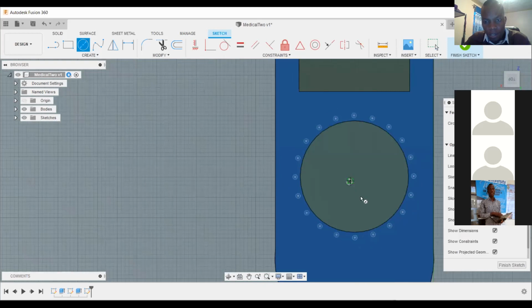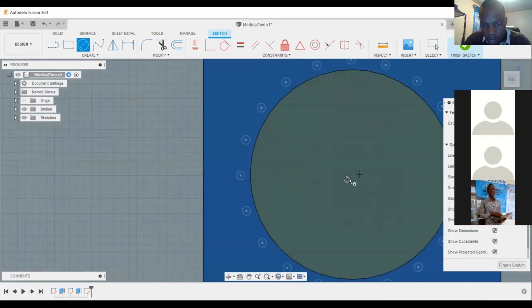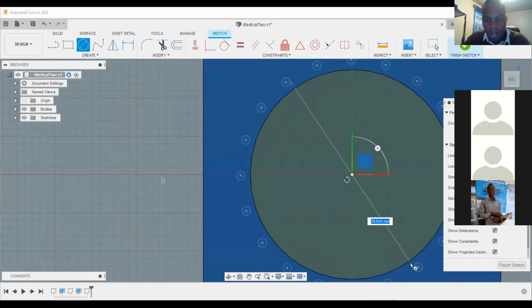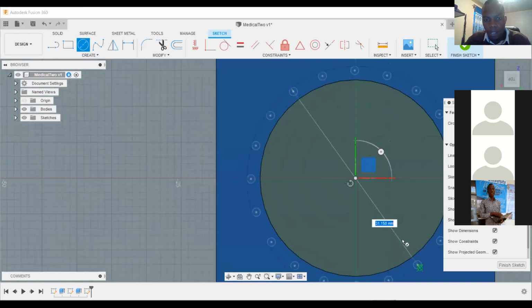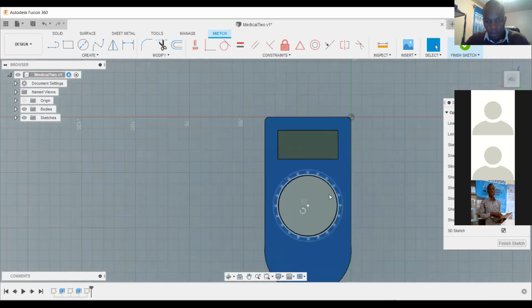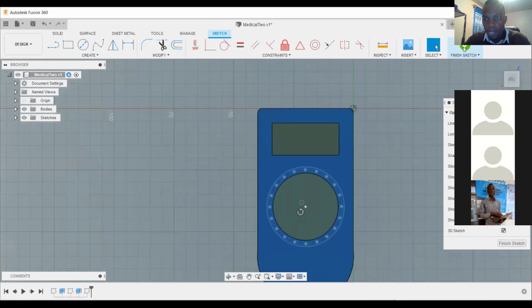You can create another. You can draw another circle outside. It's just easy to do some fancy shapes too, but we are learning, we want to learn a few things with them. So once you do that, you can finish sketch.